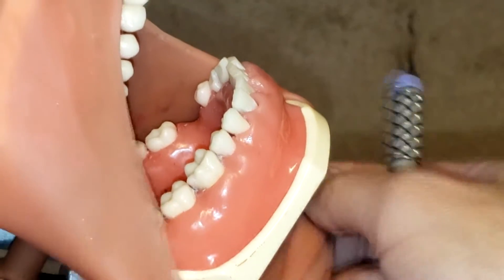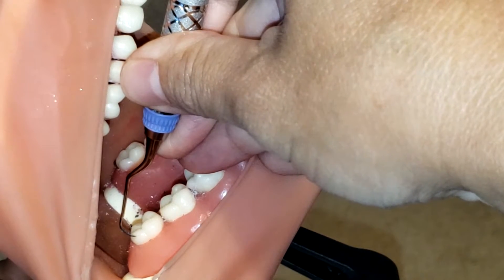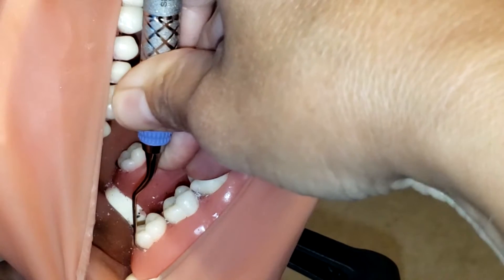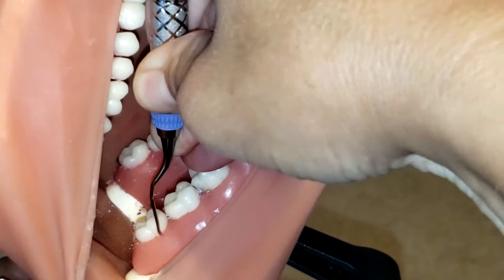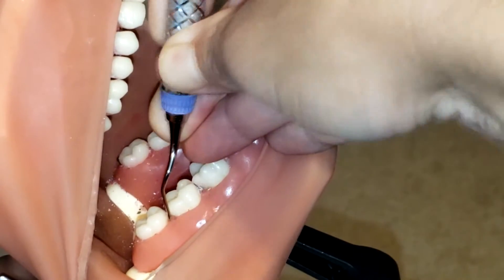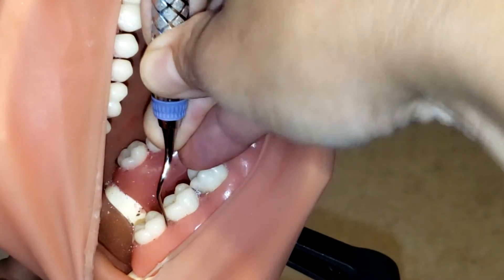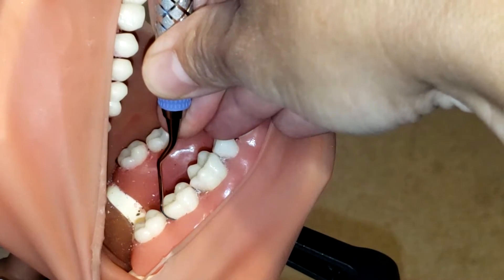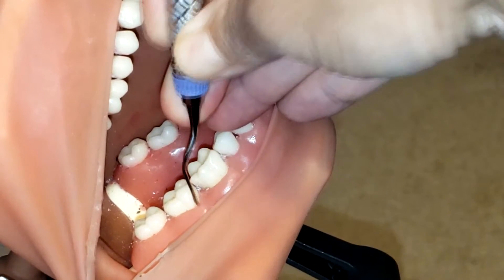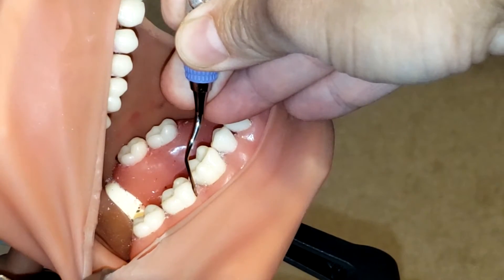Now that you know the correct working end, let's get to it. I'll start at the distal line angle of the molar, insert at zero degrees, go nicely into the pocket, and come around the tooth. As you approach the line angle, roll into that interproximal space and maintain a 70 to 80 degree angulation for calculus removal, making sure you are adapting the toe-third of the instrument at all times. Dive into the pocket and work across using vertical, horizontal, and oblique strokes — controlled strokes.